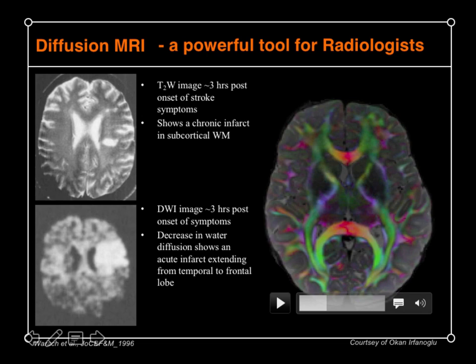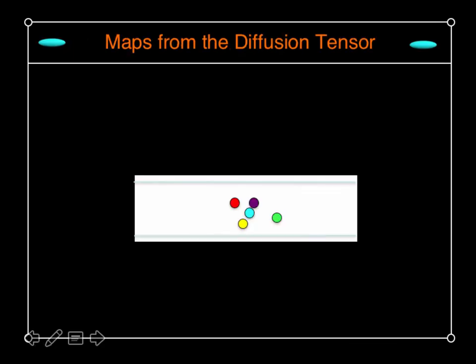And so that blob of white matter that you saw here can now be segmented into U-shaped tracts and big, large fasciculi that are projecting in the anterior-posterior direction. So it's a very, very powerful technique that has completely changed how we think about the brain. So what's going on in the guts of diffusion imaging?